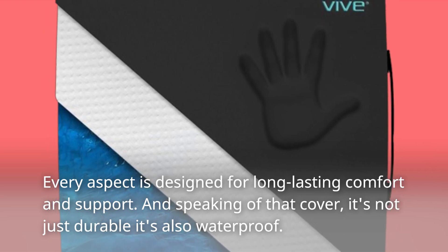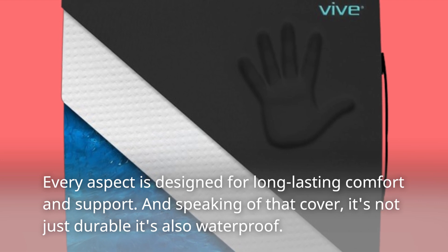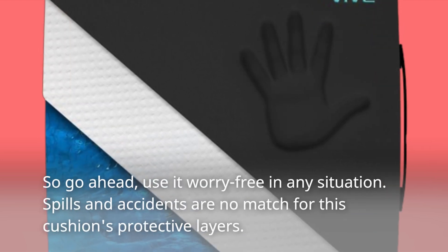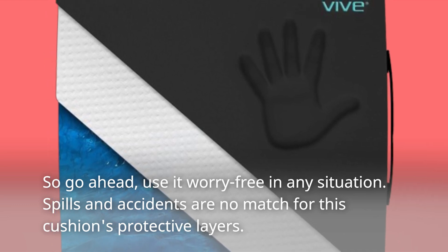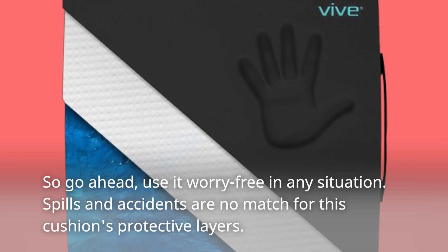And speaking of that cover, it's not just durable, it's also waterproof. So go ahead, use it worry-free in any situation. Spills and accidents are no match for this cushion's protective layers.